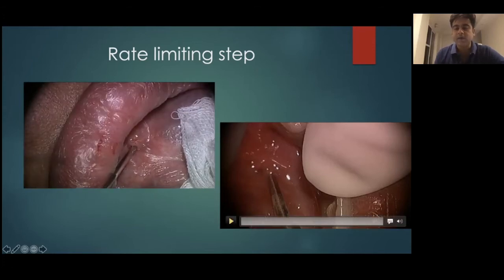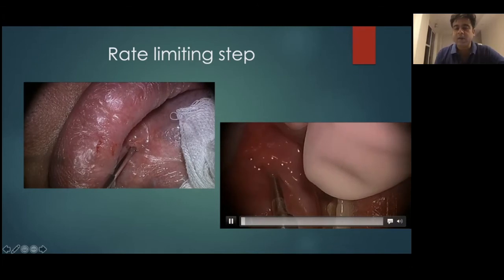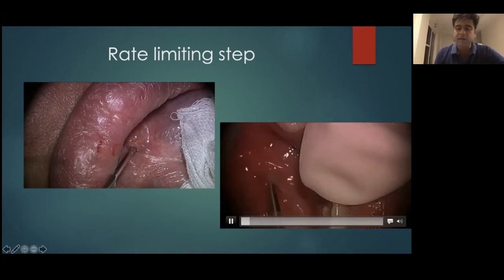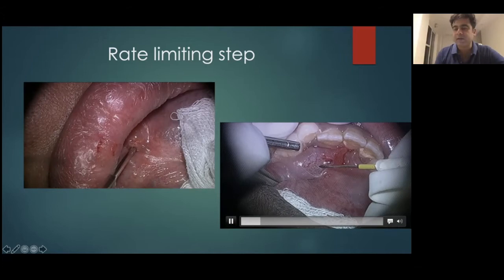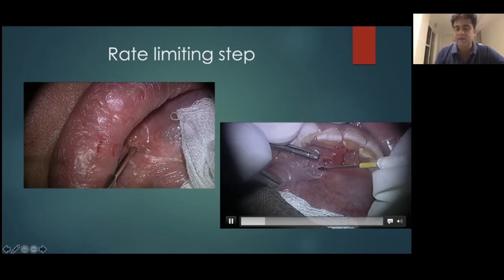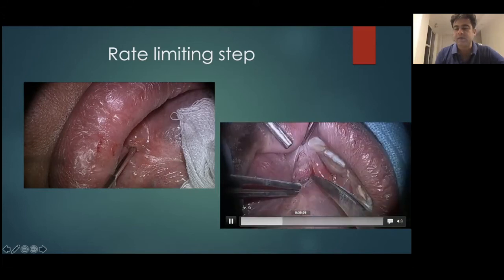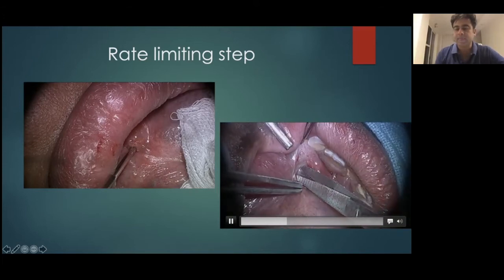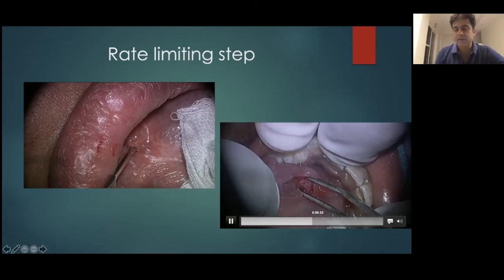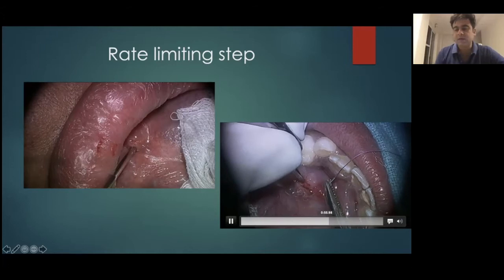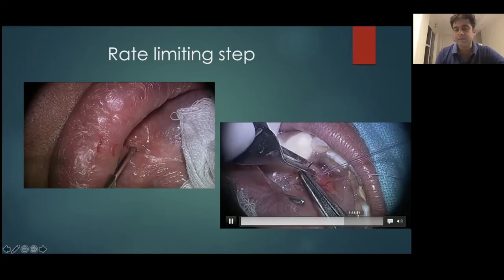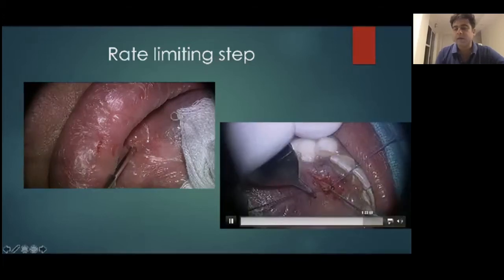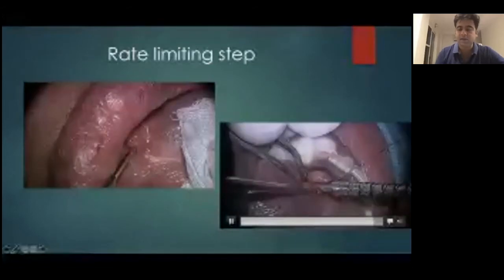In cases where you can't find the papilla — as happened to me in early days when I was overzealous and lost it — you perform a ductal cutdown: a small incision of less than a centimetre is given right over the sublingual crest. You dissect in the soft tissues, isolate the duct visible in the centre of the screen, stabilize it with two stay sutures on either side, make a small incision to gain entry, put your dilator in, and you're inside. That's how you deal with a lost or difficult papilla.